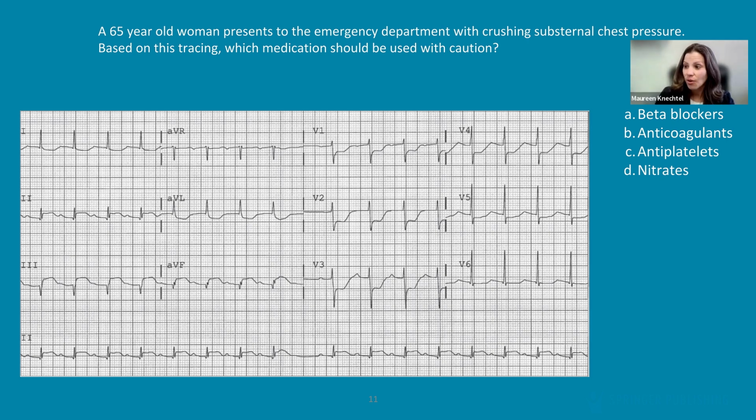Okay. So, we got some different answers here. The highest percentage chose beta blockers with caution, followed by nitrates, which is the correct answer. Nitrates is the correct answer.